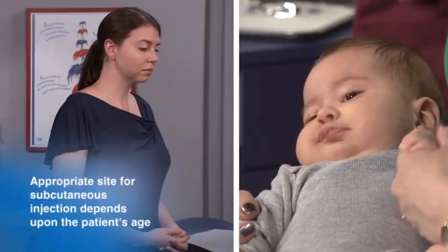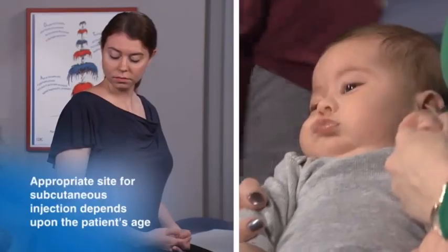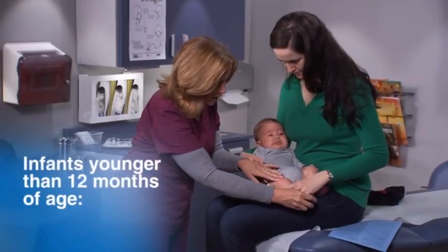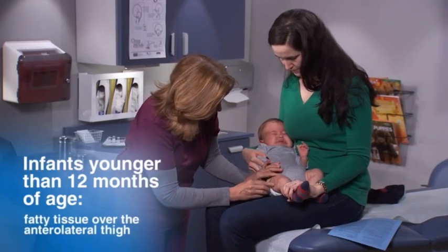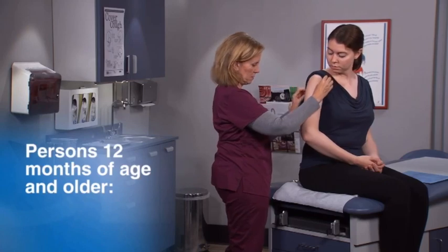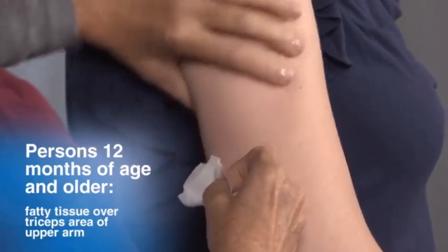The appropriate site for a subcutaneous injection depends solely on the patient's age. For infants younger than 12 months, the recommended subcutaneous site is the fatty tissue over the anterolateral thigh. If needed, the fatty tissue over the triceps area of the upper arm can also be used. For persons 12 months of age and older, the recommended site is the fatty tissue over the triceps area of the upper arm.